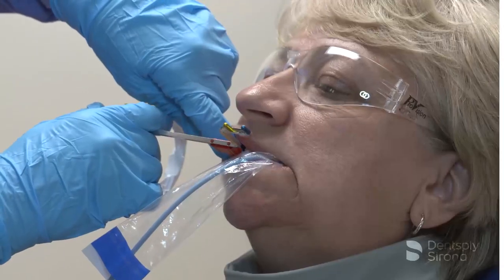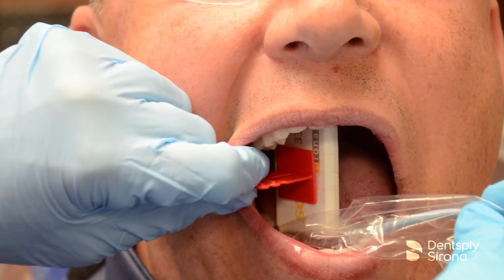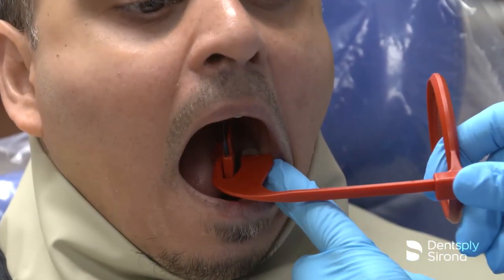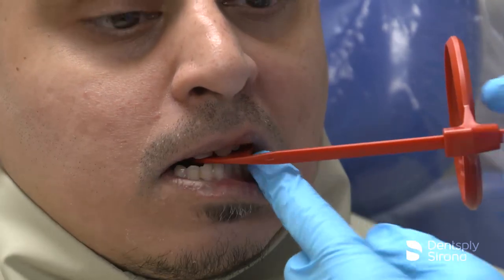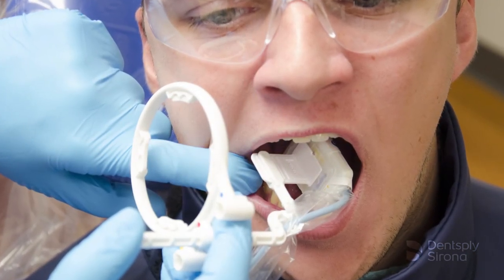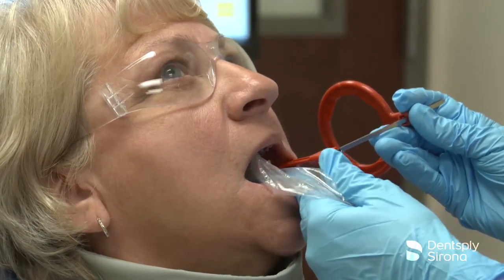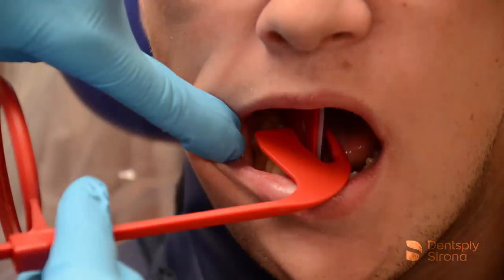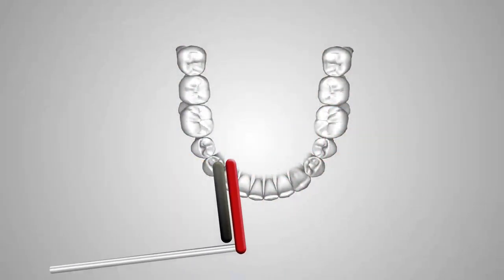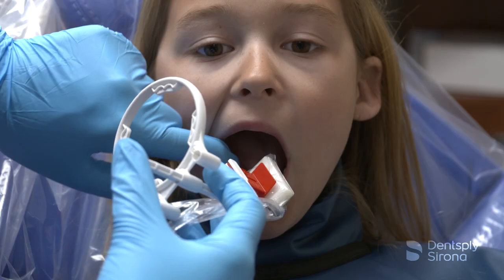Bitewing radiographs are considered part of the routine dental assessment. It may be five to seven years between full mouth sets, and bitewing X-rays are an important diagnostic tool to monitor disease and health during this time interval. To properly detect caries and periodontal disease, it is essential to capture open contacts between teeth and maxillary and mandibular bone levels. It is important to ensure that the central ray is perpendicular to the image receptor. Placement for the premolar bitewings will often require an adjustment of the sensor to capture the distal of the canine and avoid overlapping.